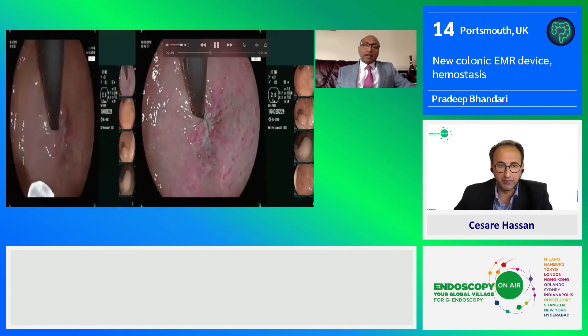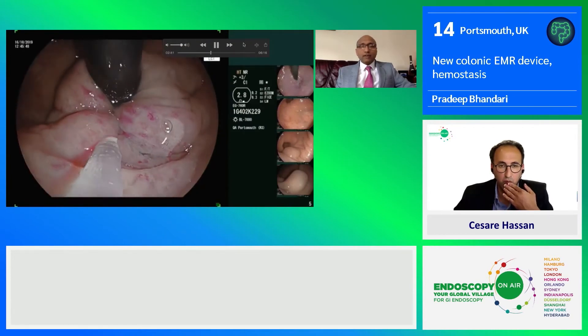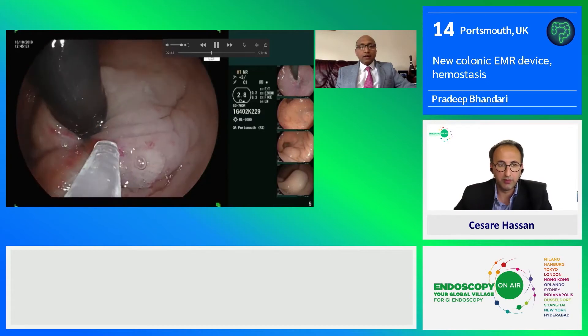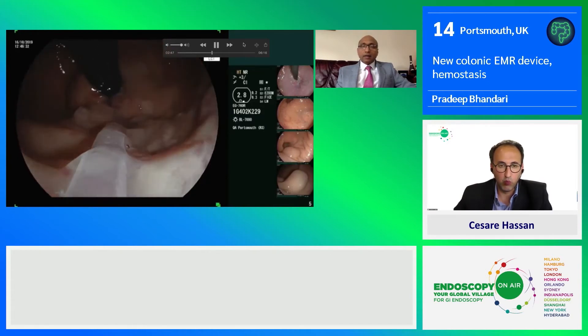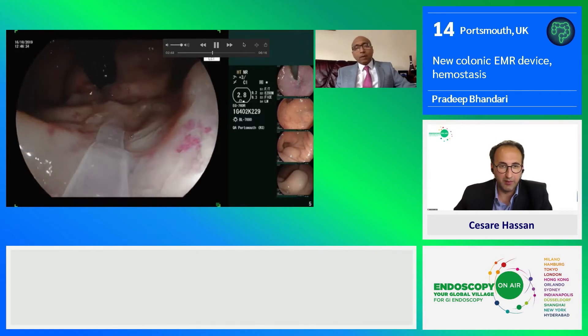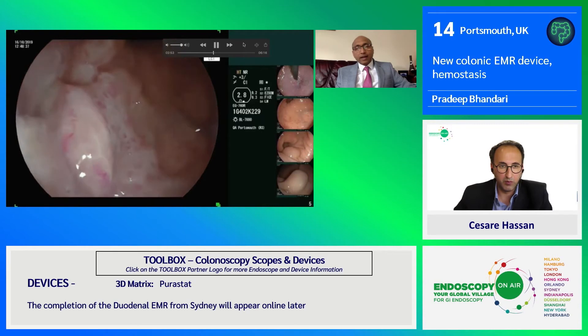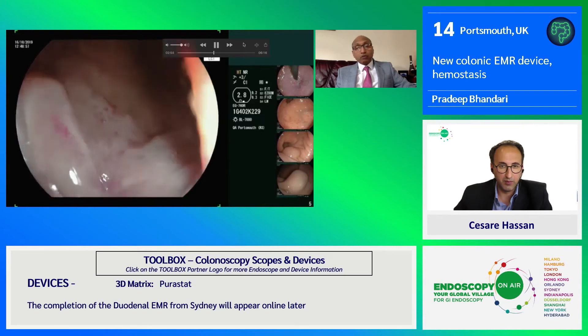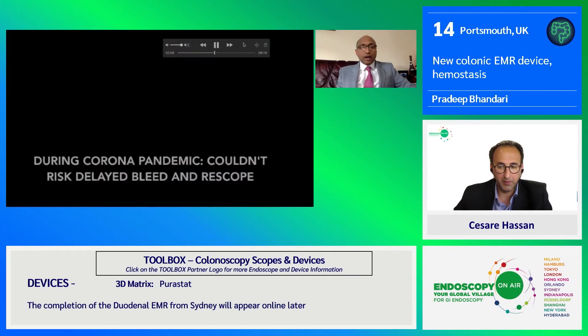Another indication for PuraStat is radiation proctitis. The patient has come for the second round of application of PuraStat and you can see it has already subsided. You can also do ablation with APC or RFA and then apply PuraStat — it has been shown to produce very impressive results, and an RCT is now underway in the UK.